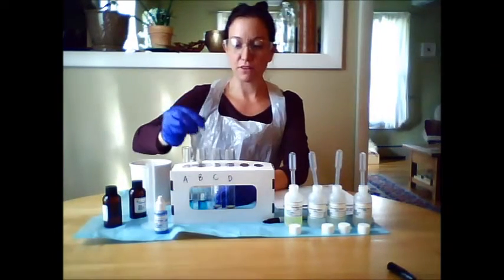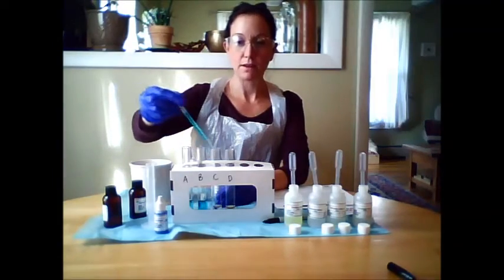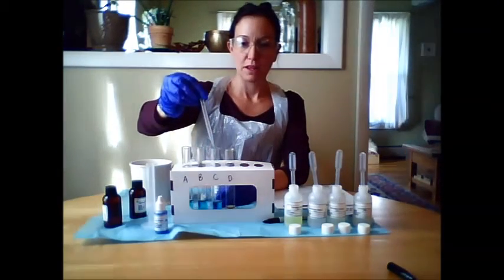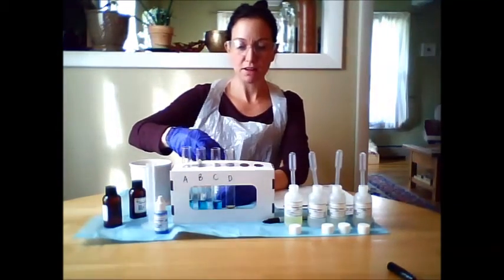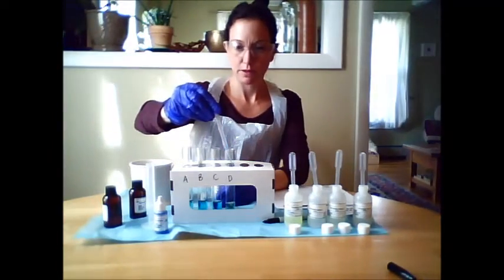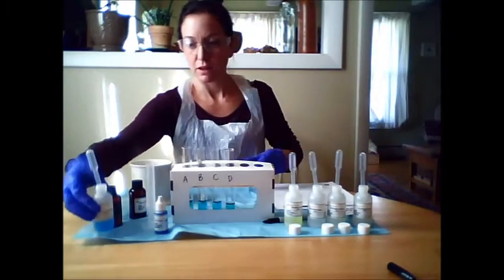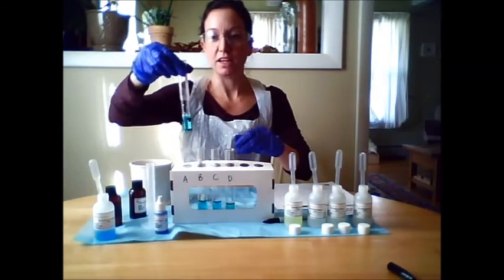So instead of using a graduated cylinder, we can use the graduated pipette and measure as we pipette and dispense our liquid. There's 3 milliliters of the Benedict's in each.